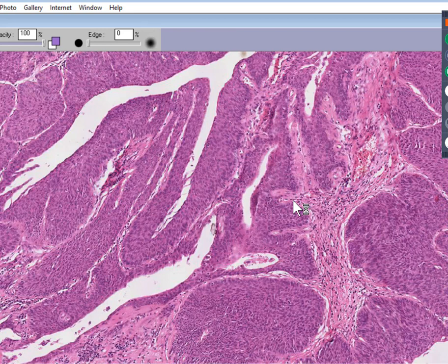So you might call this transitional cell carcinoma. Because if you remember, the transitional epithelium, most of which is in the lower urinary tract, lines the calyces, the pelvis, the minor and major calyces, the ureter, the bladder. This is all transitional epithelium, and it looks a lot like this. So this is a papillary transitional cell tumor.